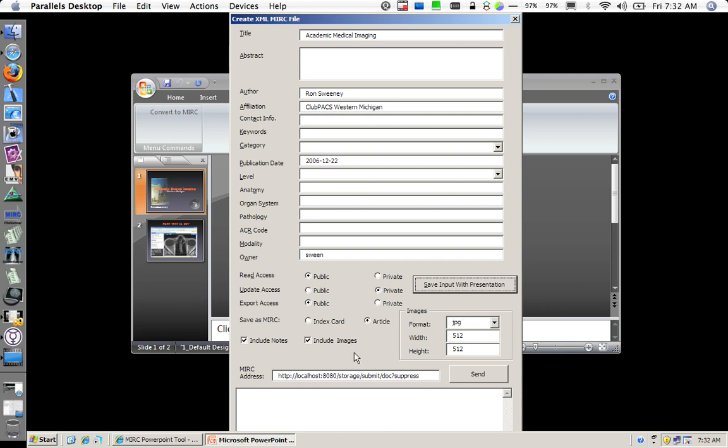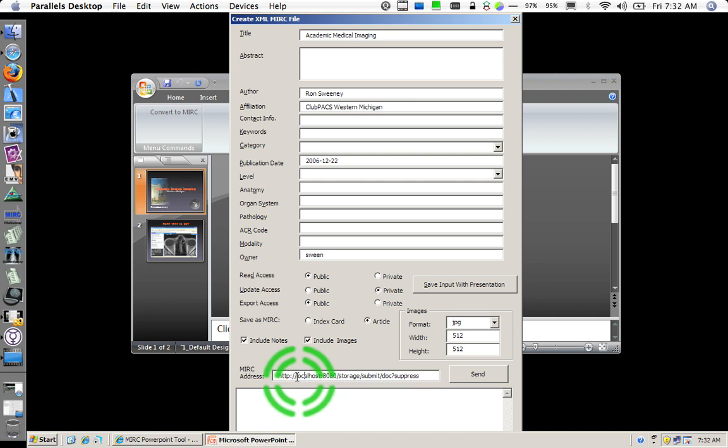And you can set a size there as well. Now another important part is your URL.